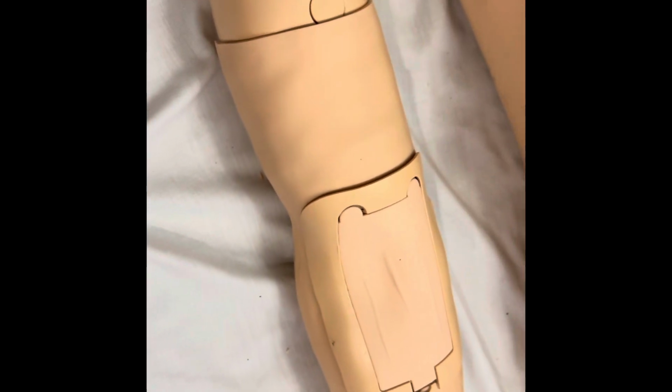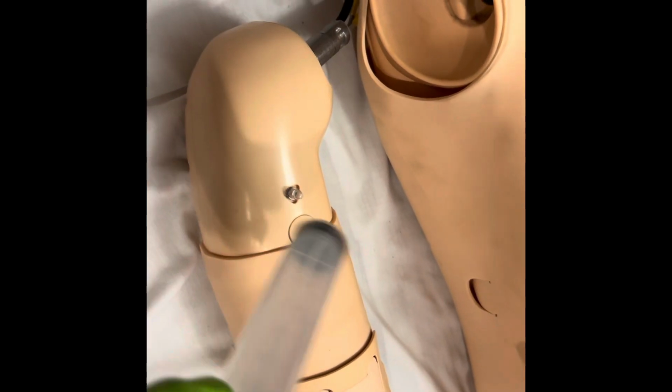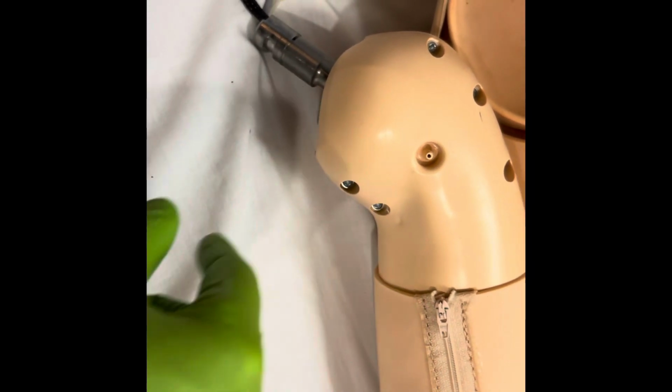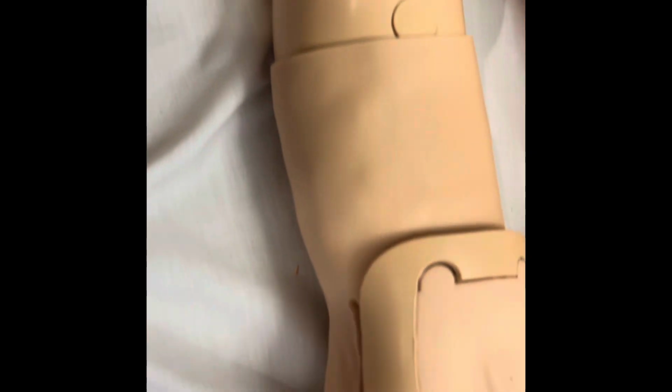Next thing we want to do is actually put some distilled water in here and test the flow. Then go ahead and put your drain bag on the back side here to make sure that it is flowing correctly. While you're doing that, you want this to be open so you can visualize if there are any leaks. So have that open when you're pushing fluid through.